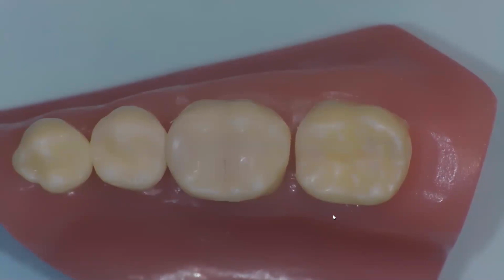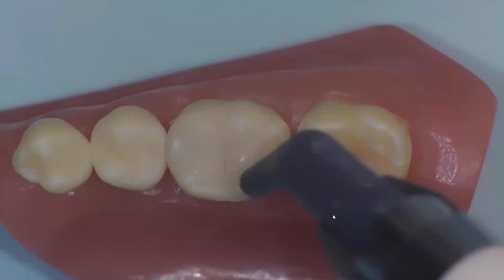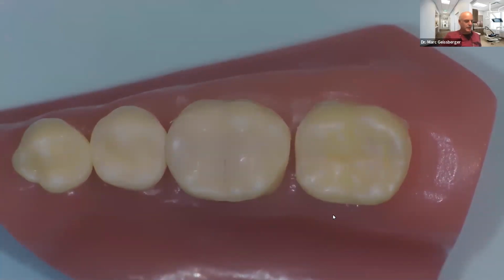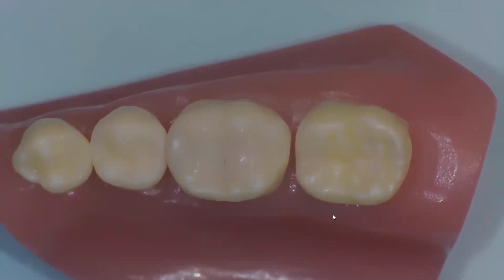Our next question reads, I noticed you didn't use the composite gun directly into the box prep, and you administered the packable composite with your instrument. Is there a reason why you did it this way? Yes, that's a great question. I love that question. It actually gets down to being precise.